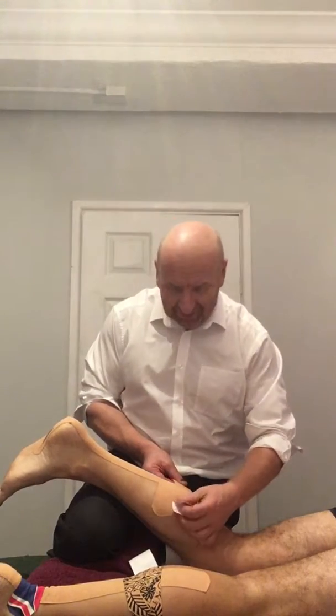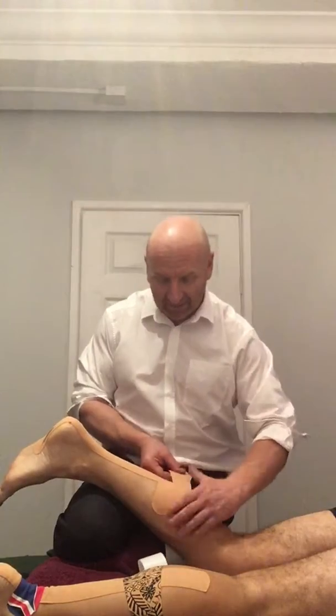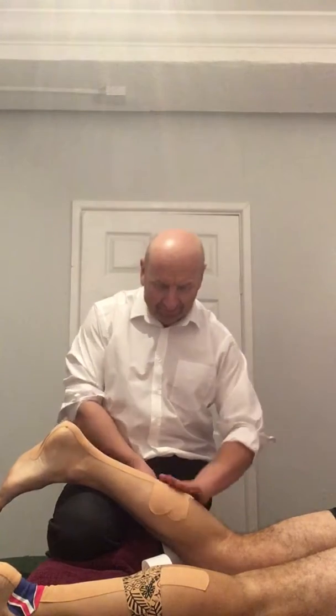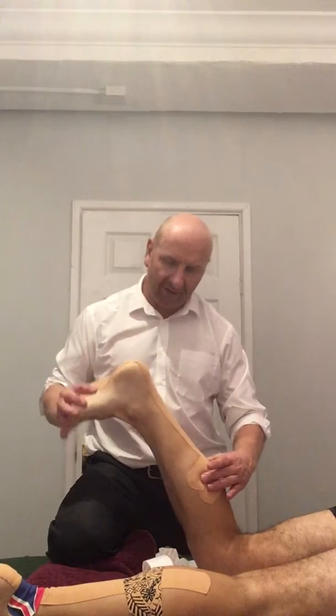Dynamic tape is starting to come over to the UK, but it's pretty slow at the moment. I'm starting to experiment in the clinic with it. So I grab the tissue, pull it across, and lay that down. And you can see that he's got that little bit of recoil there.